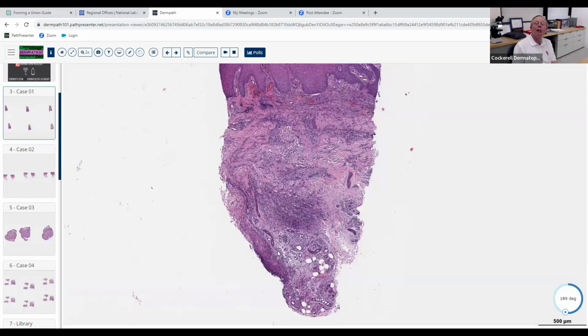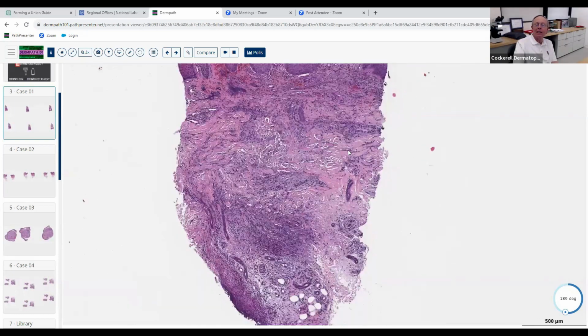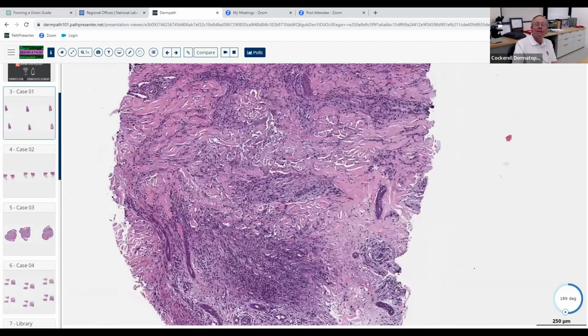What kind of pattern do we call that? I don't know, dispersed. It is dispersed, but when it's forming inflammation around something, like, oh, there's some palisading? Yeah, palisaded. Okay, good. And so we have histiocytes, we got some neutrophils, we got a palisaded pattern of inflammatory process.